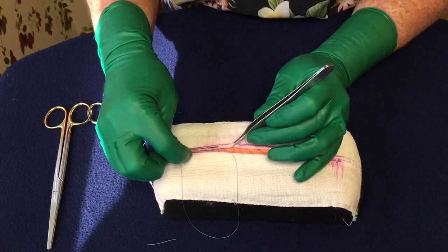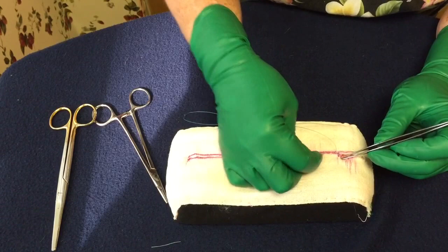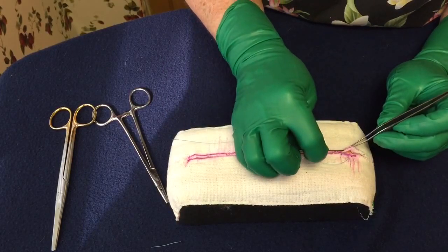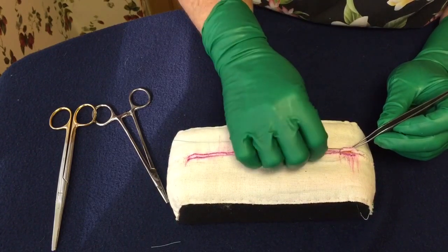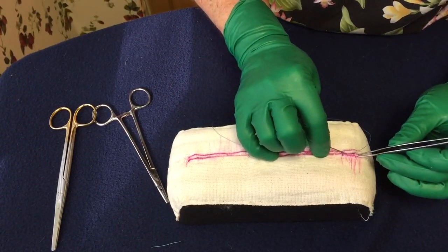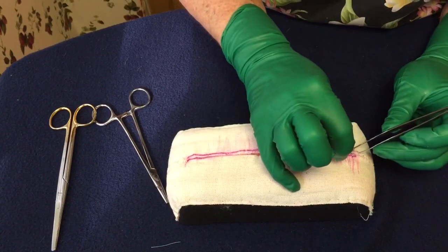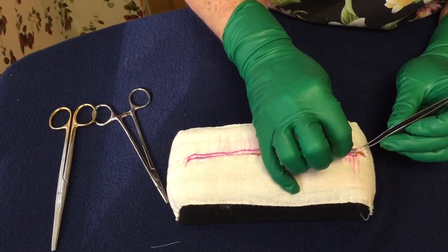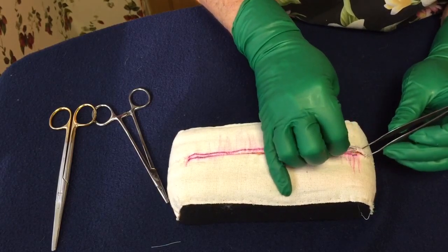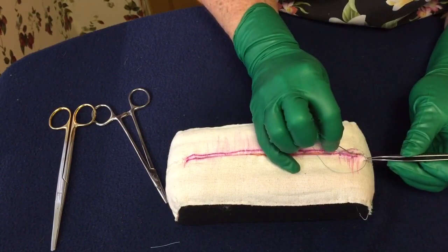Of course you want to be careful that you didn't put a hole in your glove. What you can do — like I said on the original option — is just leave a tag out and Steri-strip it down, if you're not comfortable with that for whatever reason. Here at the end, I would come in and start doing it the right size again. When you get to about two centimeters away, don't pull it tight because you want to be able to get in here. So I'm going to go in and try to get two more stitches — I'm not going to pull it tight; I'm going to leave it a little loose so I can pull the skin away and see what I want to see.